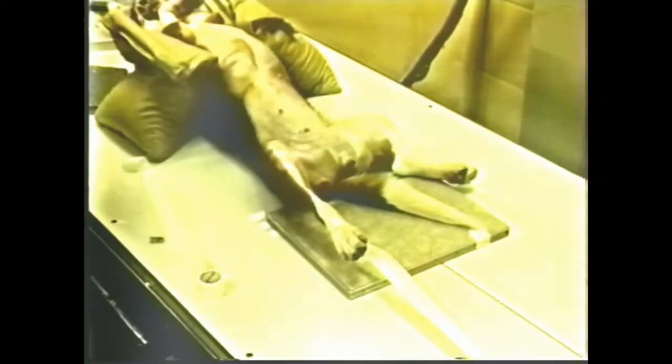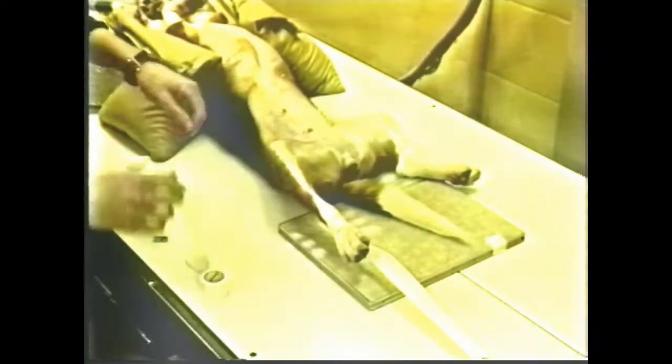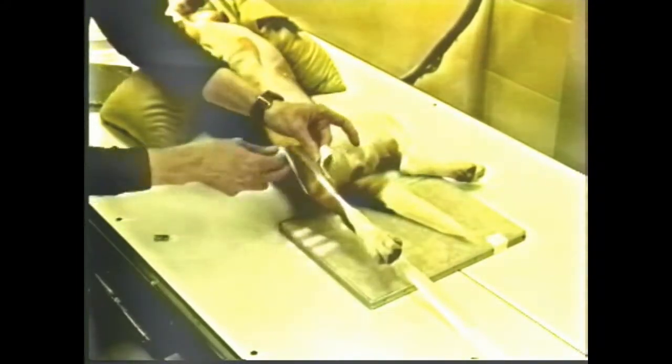The animal is then prepared for the craniocaudal view of the tarsus. The animal is placed in dorsal recumbency with the leg of interest extended. The leg is taped to the table. Another tape is placed around the stifle so the leg can be rotated to obtain proper alignment of the tarsus for the exposure.